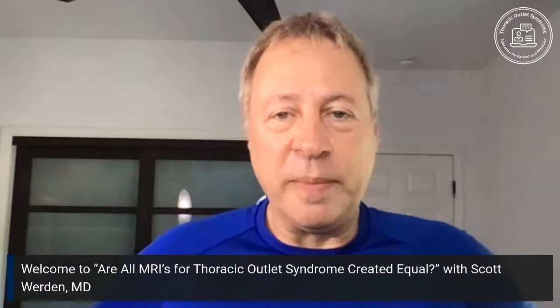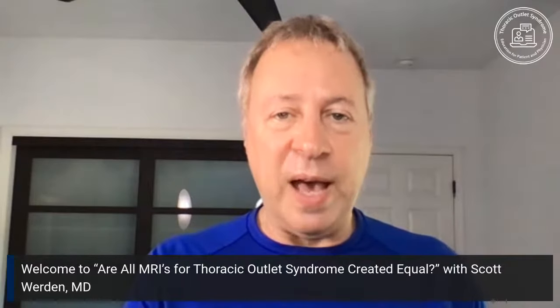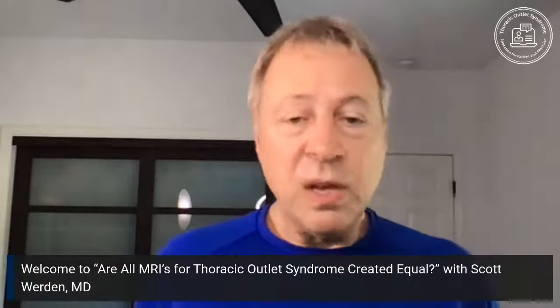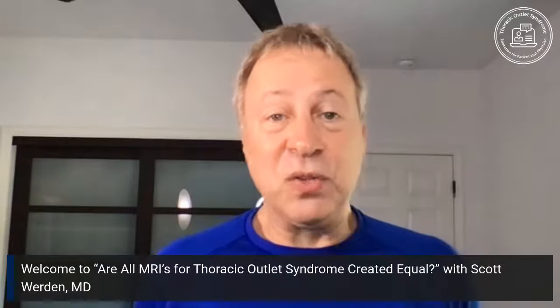Not only do I see this in the reports that I get from other radiologists, which I review, of course, with prior images to see what information we already had or what changes occurred from then until now when we do imaging, but I also hear this from the referring doctors. And I have to say, if radiologists don't pay attention, they should. There's a lot of referring doctors who talk to me and, even over the phone, you can hear them rolling their eyes. I order an MRI, and what do I get back? The brachial plexus looks normal, and that's it. It's not useful to me.